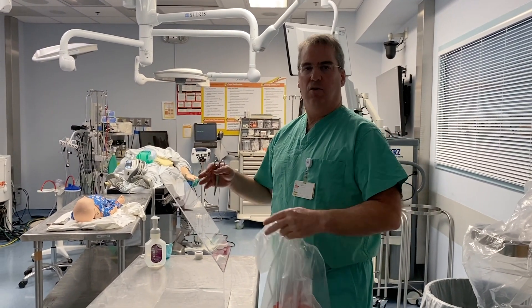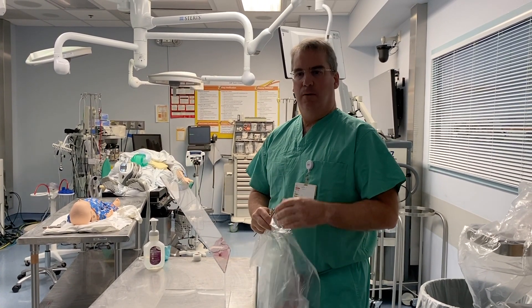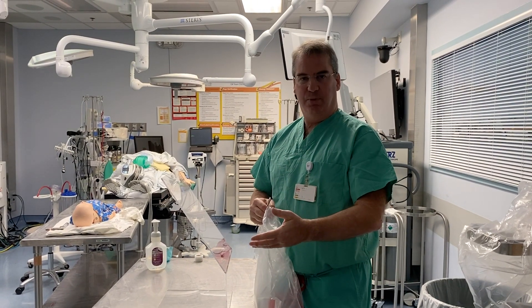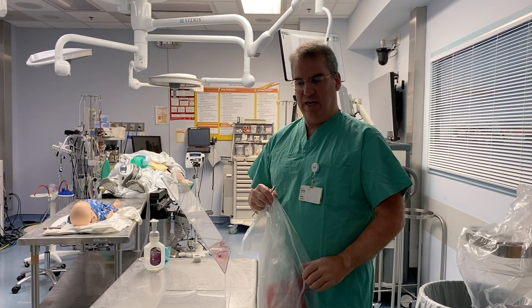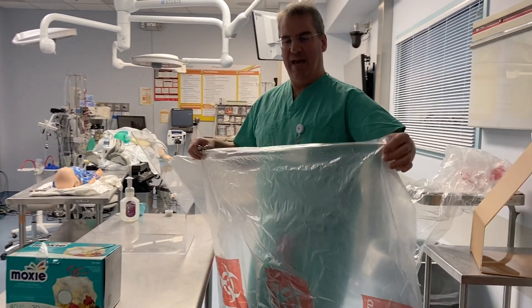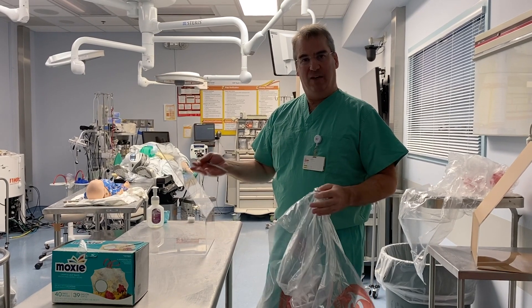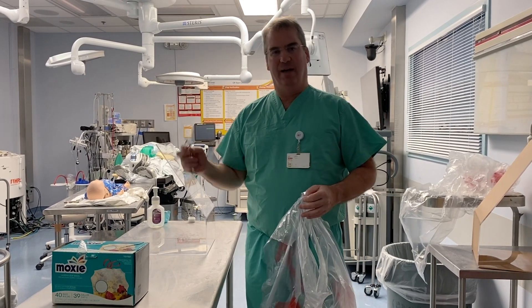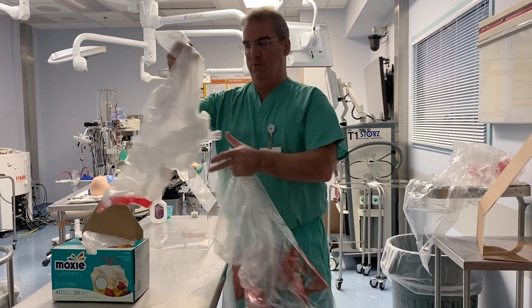In order to create the tent, or the rest of the protection for the healthcare providers, we need preferably clear plastic so that we can see the patient underneath. It can be done with any clear plastic bag, but in the absence of a plastic bag, it can also be done with painter drapes, preferably with a little bit higher thickness than the very thin. It can also be done with clear plastic garbage bags.